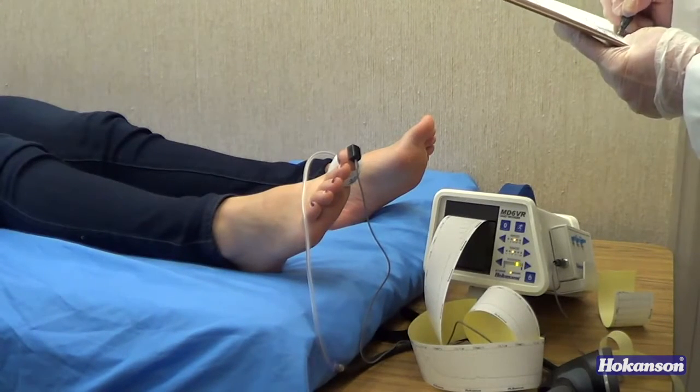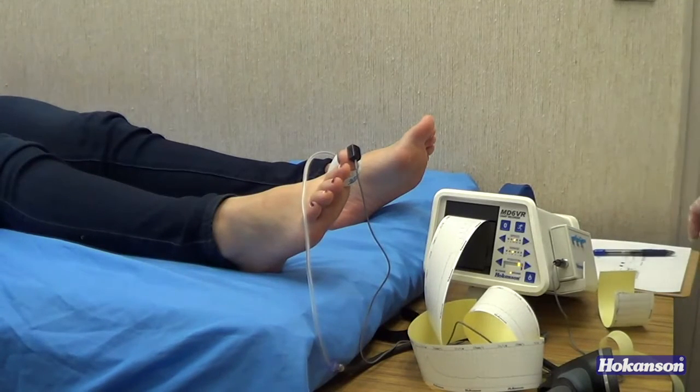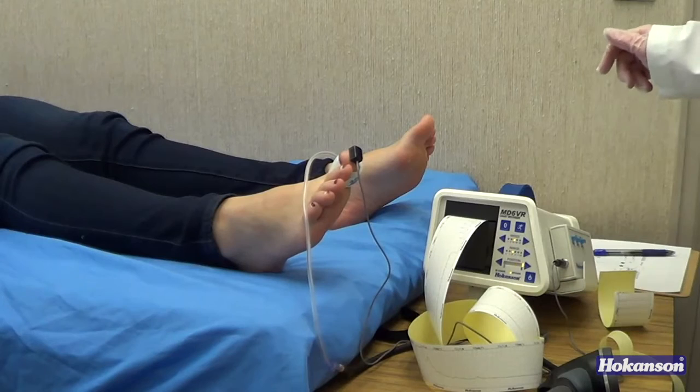And those are the steps needed to take a toe pressure with a photoplethysmograph, the Hokanson toe pressure kit.